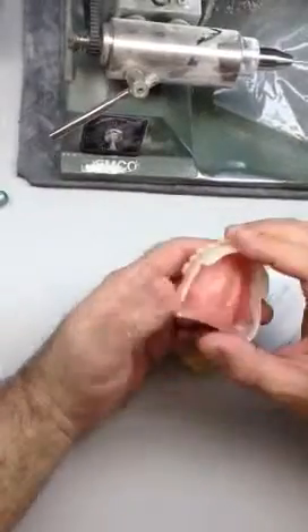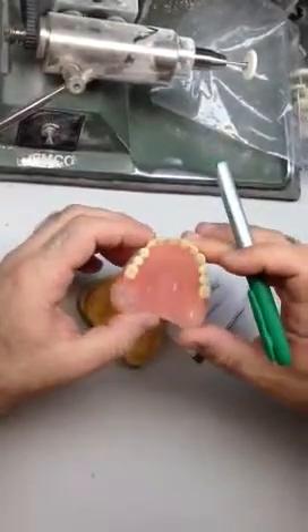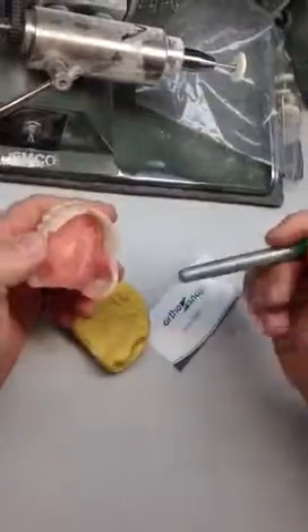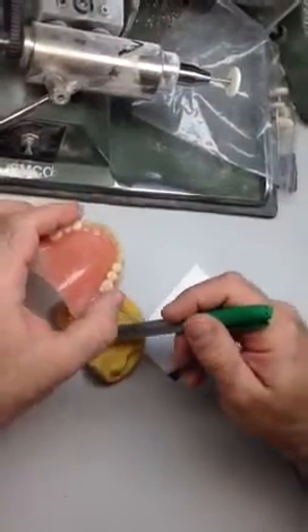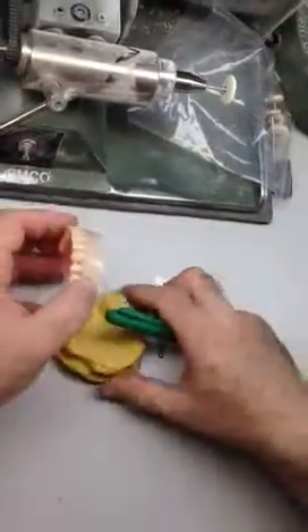As you can see, the denture itself is traditional hard acrylic, so the denture will keep its integrity and form as the patient needs. Because if the whole denture were flexible, we would lose adhesion and suction. So we have produced the palate which will allow us to create suction with a traditional post-dam, as the denture is normally processed.